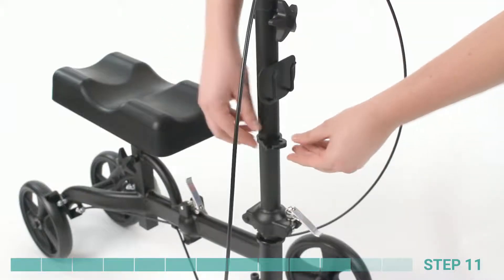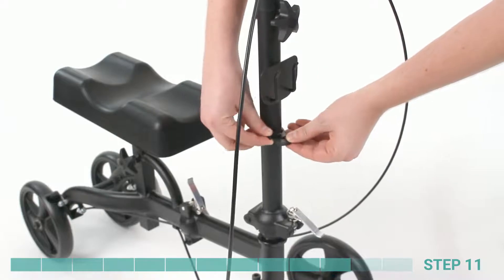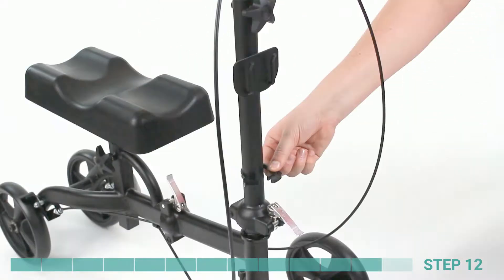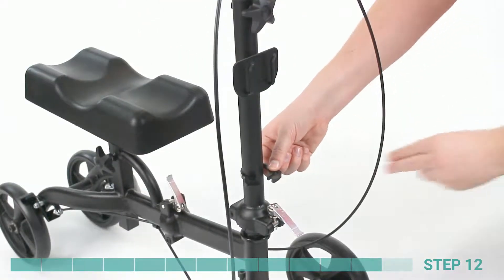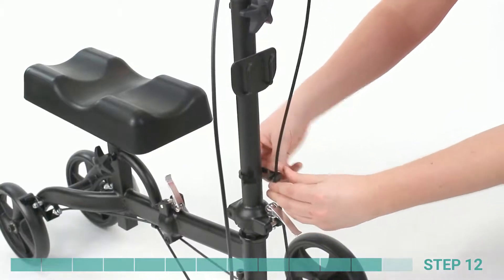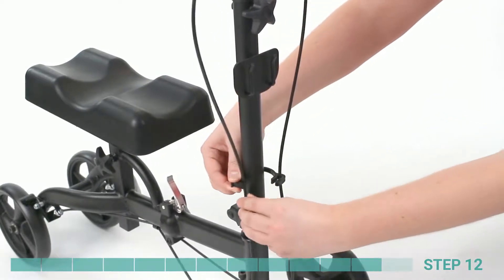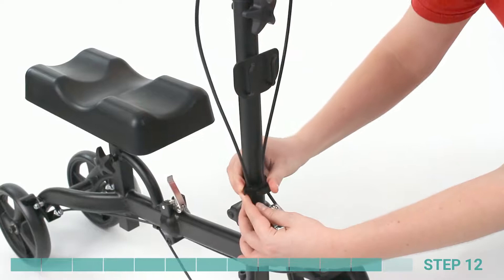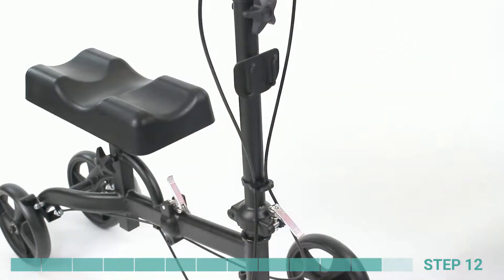Step 11. Locate the brake cable fastener and fit around the steering column. Step 12. Insert each brake cable into the slots in the brake cable fastener. Squeeze the ends of the brake fastener together until the plastic teeth secure into place.